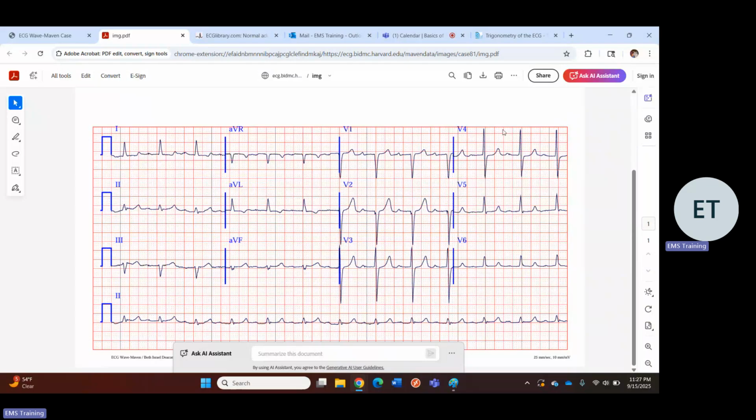Could this person have some sort of ventricular hypertrophy? Yeah, probably. So what's abnormal? What stands out? Really small QRS gain here in lead 2 and AVF. The T wave looks kind of large in comparison. Is that abnormal? I don't know. I don't have enough context to say. If the patient had chest pain, then I would be suspicious of it. Inverted T wave. Flat ST segment. I don't like that.